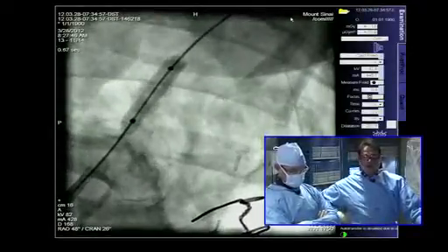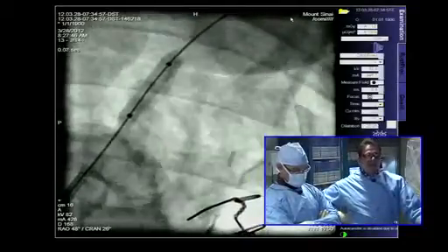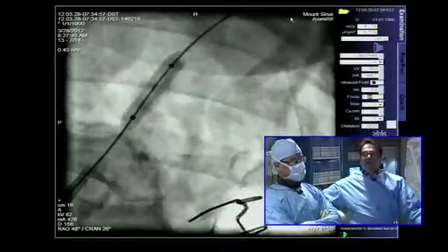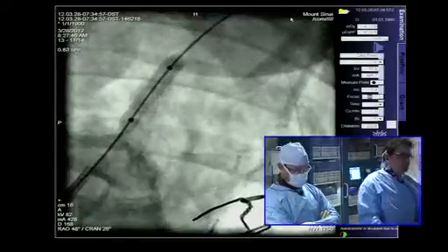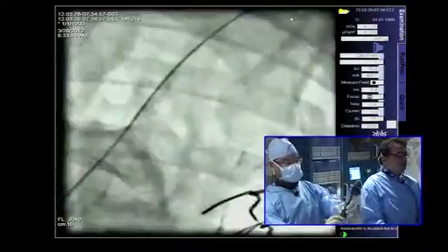As you know, embolization does occur in everything, but here, hopefully, because of that angle and the tortuosity of that vert ostially, it would be less likely to occur. But I don't think we're able to predict these things, and I think that's a great question. And I really believe it. Can you rail me, please?